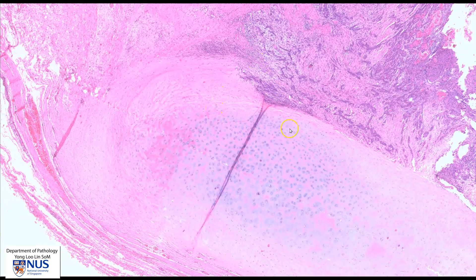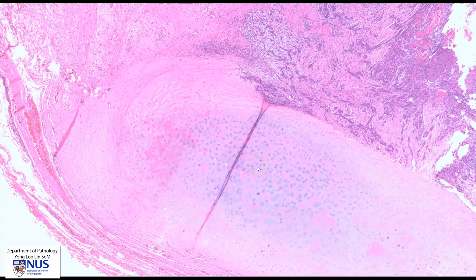So we would have to take sections here and sample this area to see if the tumor is truly invading into the thyroid cartilage.